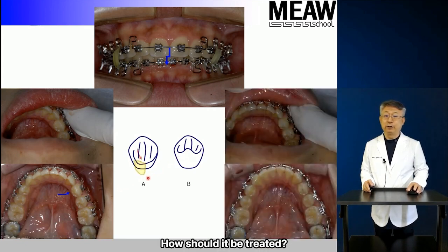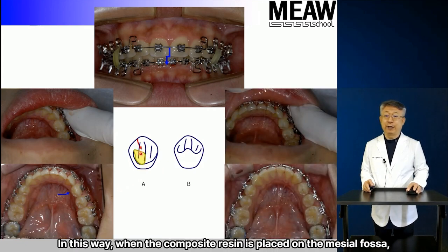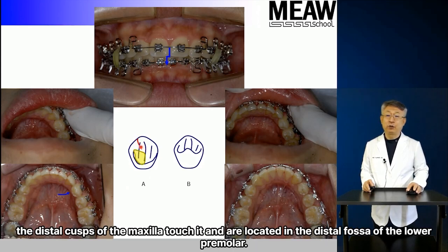How should it be treated? In this way, when the composite resin is placed on the mesial fossa, the distal cusps of the maxilla touch it and are located in the distal fossa of the lower premolar.